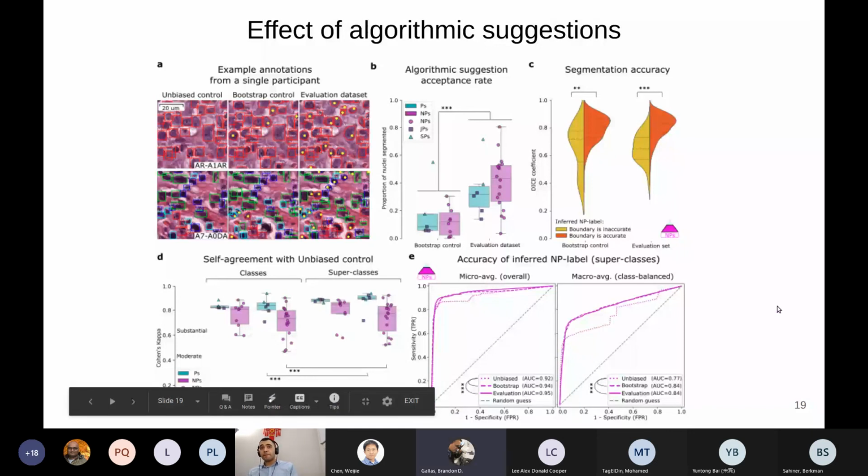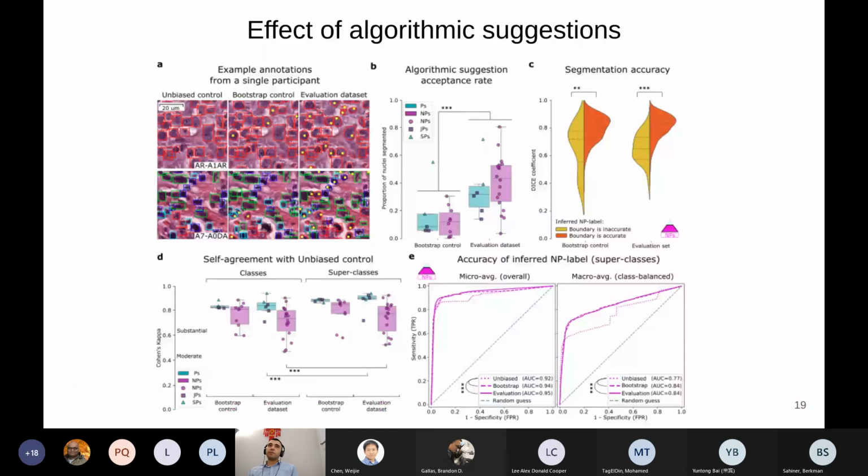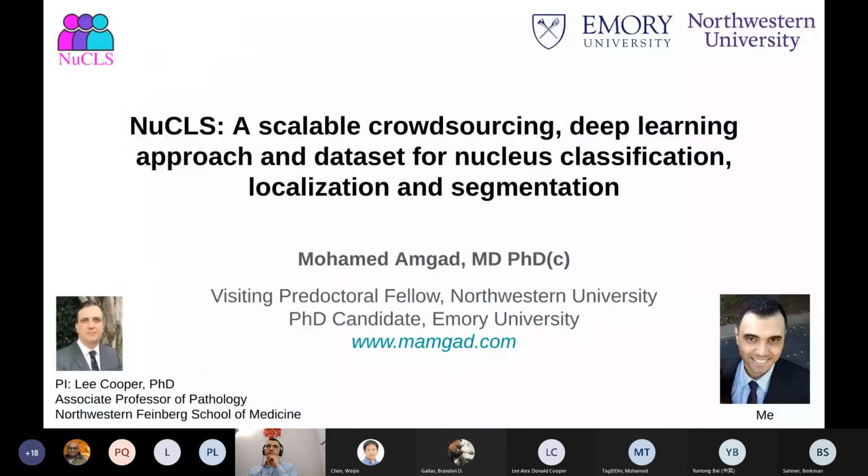Of course, that's driven by how good the suggestions are. Absolutely. It's highly algorithm dependent, but I would argue that our initial algorithms are actually pretty weak. They're just Gaussian and thresholding and things like that. Let me show you this slide here.